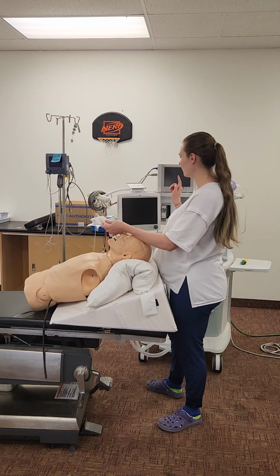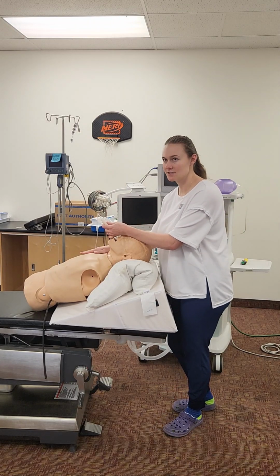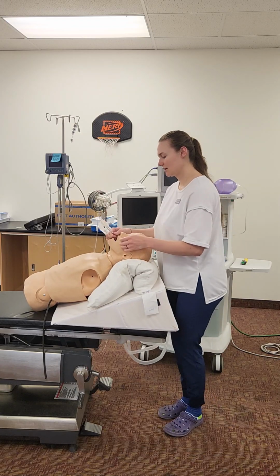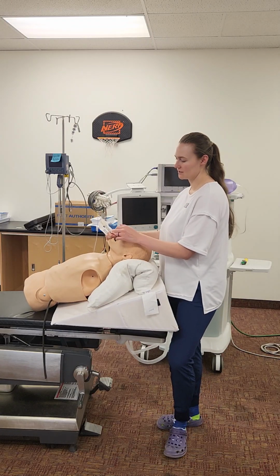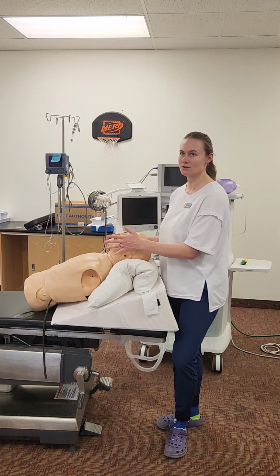and then I can watch for ETCO2, and I can watch for chest rise, and also listen in addition for chest rise. And then once I feel like it's in a good spot, and the tube is misting, then I can inflate the cuff and then secure it to his face. So now this is taped or tied.